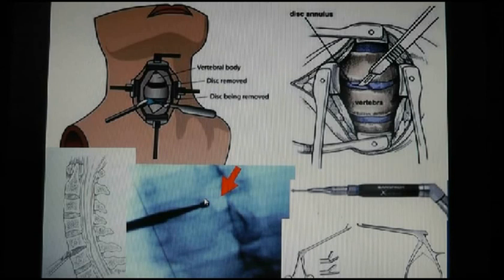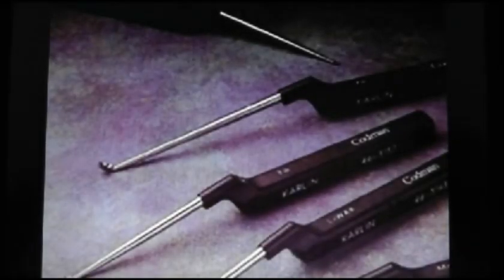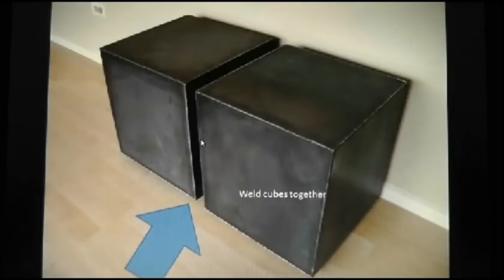And I always remove the posterior longitudinal ligament and look at the dura itself. Not everybody does that. I do it because I want to make sure everything's out. People say it's not necessary. But if you don't do it, you could potentially miss a disc fragment that has migrated through the PLL and behind the vertebral body. So that's something that I always do. And these are what the curettes look like. These are kind of old curettes, but they have a cup, and you go into the spine, and then you lift things away from the spinal cord.